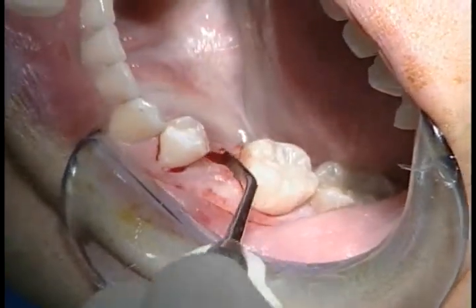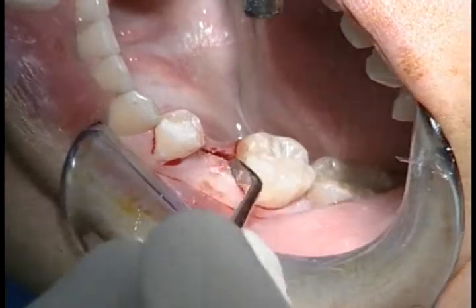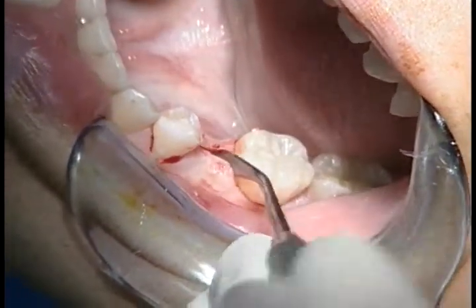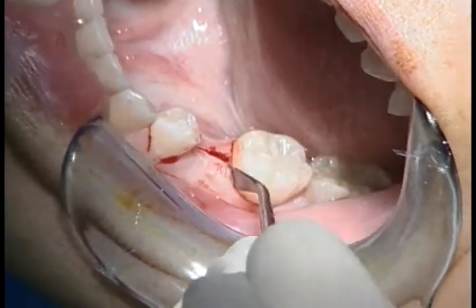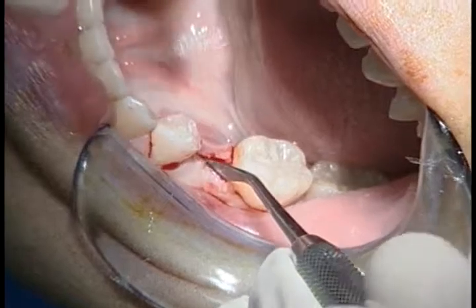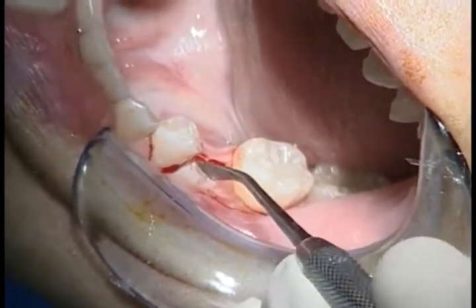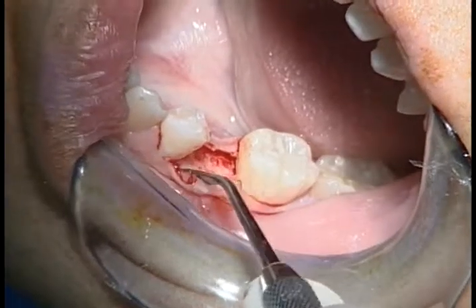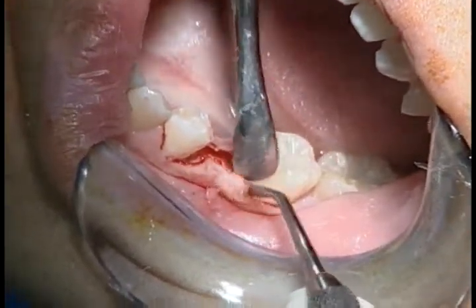It is usually much easier to elevate the lingual aspect of the flap first, and then proceed to the buccal aspect of the flap. You will note that there is very little bleeding present on this video. This is more of a matter of proper flap incision and reflection than it is hemostasis gained by the local anesthetic.